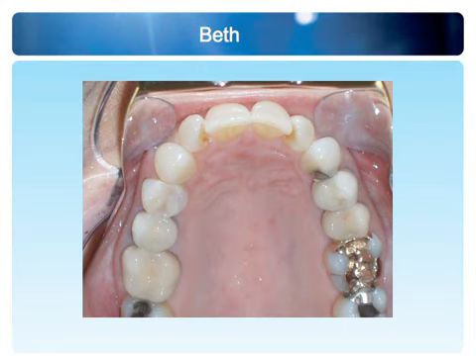In order to draw the canine distal buccal, I can set up the posterior teeth to be wider. And by expanding the arch, driving the arch a little wider, we produce the room to draw the canine back to unravel the lateral. And so, when we measure the transverse dimension for Beth, if we measure the transverse dimension at 31 or 32, we know she's a little shy.